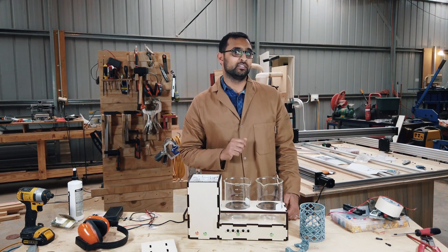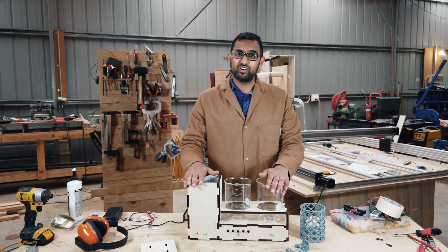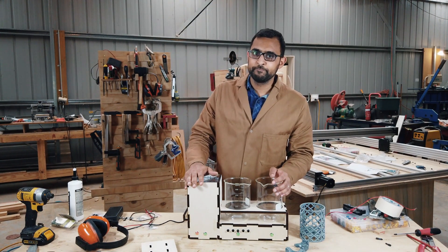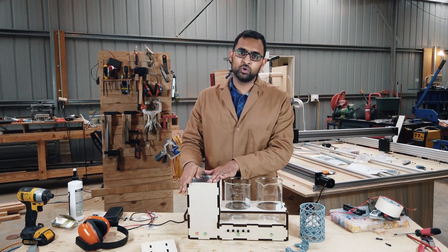Which is not terribly easy to say. But essentially this takes the role of all of those UV nail bars, alcohol bars that you've got in your lab making a mess everywhere. What we've got is a neat little station: dirty alcohol, clean alcohol, UV curing chamber.